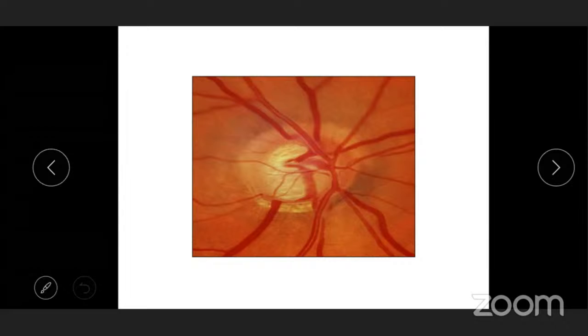So these are the important ones. This is not the comprehensive list. There are some soft signs which I purposely avoided just to keep to the duration of the talk which was given to me. This is a classical glaucoma picture, and the large parapapillary atrophy all around is typical of glaucoma.